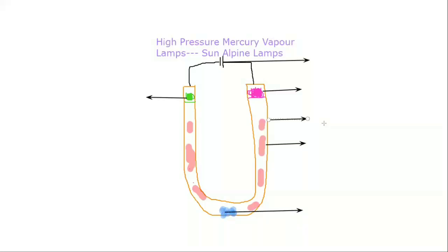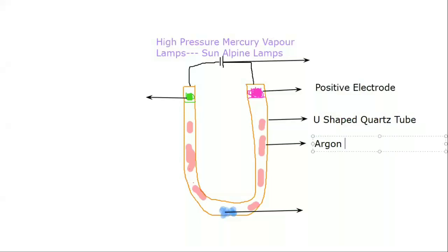Yes, so positive electrode, U-shaped quartz tube, argon gas under low pressure.